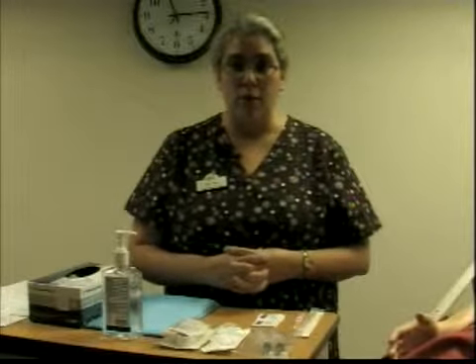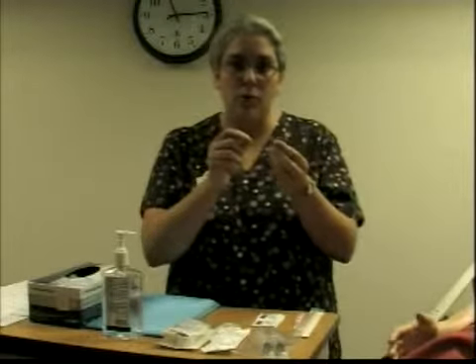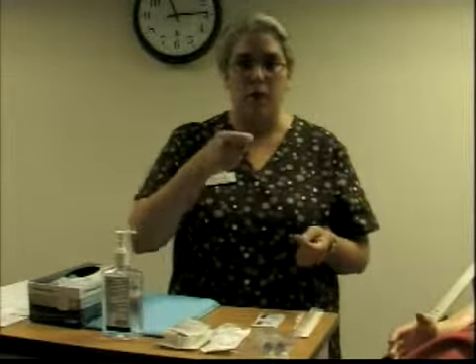So the next thing that you want to do is to look at the patient's fluid status. If your client is dehydrated, you can foresee that you will have a little bit more difficulty puncturing the vein because the veins will be flat. If the client is overhydrated, on the other side, it also will be difficult because the veins become engorged, and you will have a little difficulty puncturing that vein as well because they roll and they move.